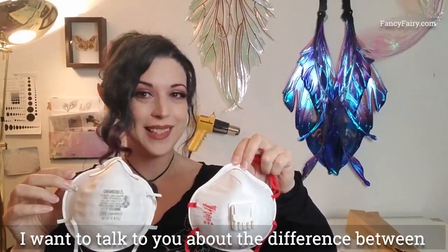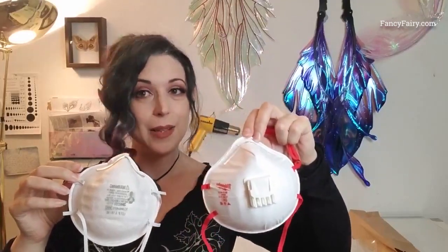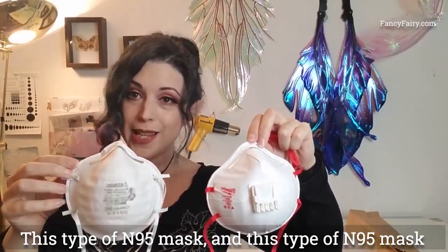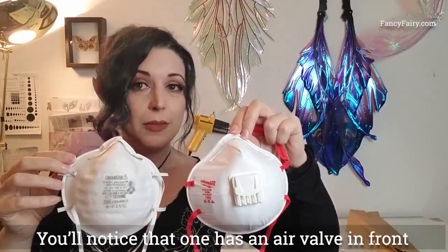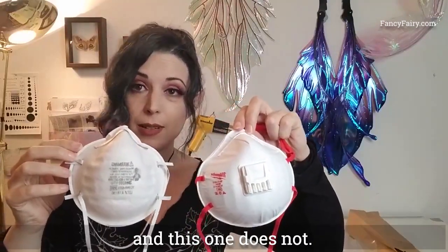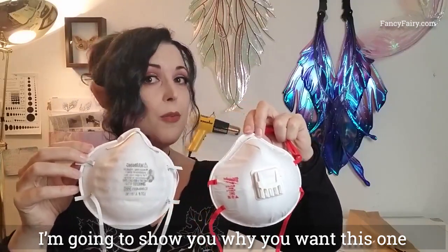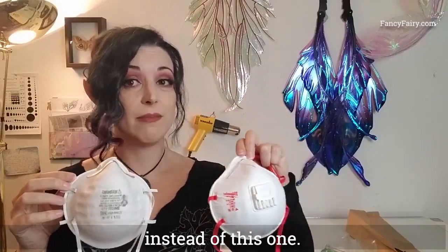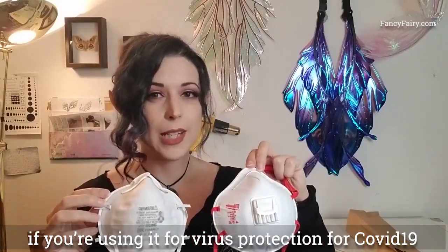I want to talk to you about the difference between this type of N95 mask and this type of N95 mask. You'll notice that one has a valve — an air valve in the front — and this one does not. I'm going to show you why you want this one instead of this one if you're using it for virus protection, especially with COVID-19.